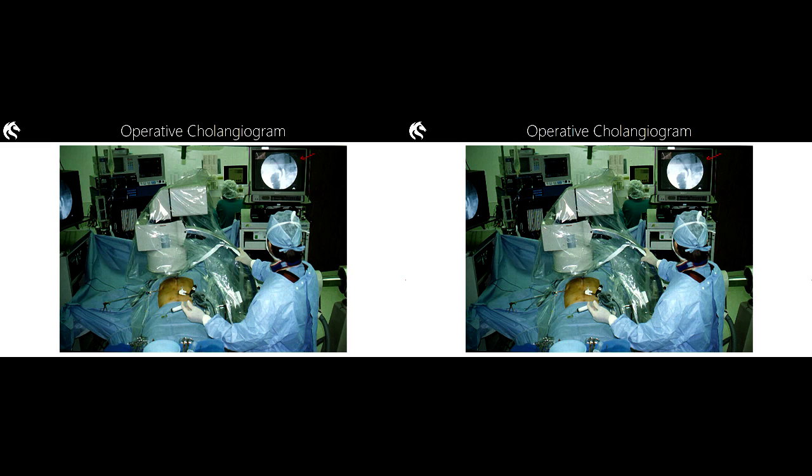The surgery is called a lap chole, a laparoscopic cholecystectomy. The procedure which a radiographer will do as part of that examination is an operative cholangiogram. I'll say the next bit slowly just so it's clear. The surgery is commonly referred to as a lap chole.